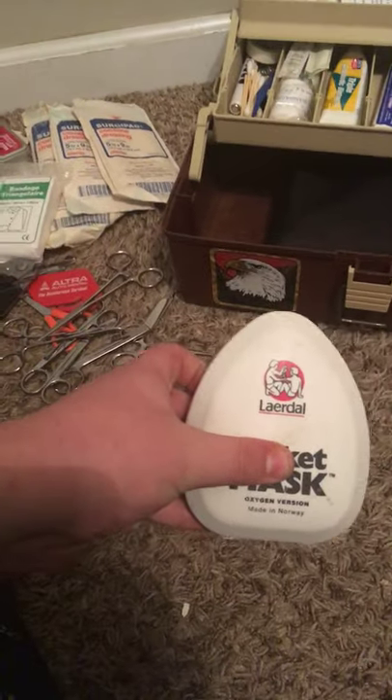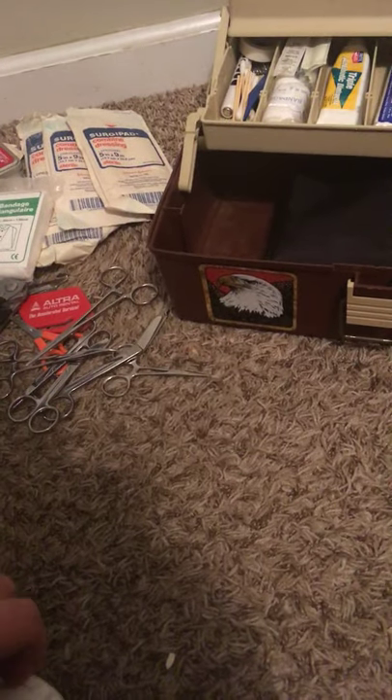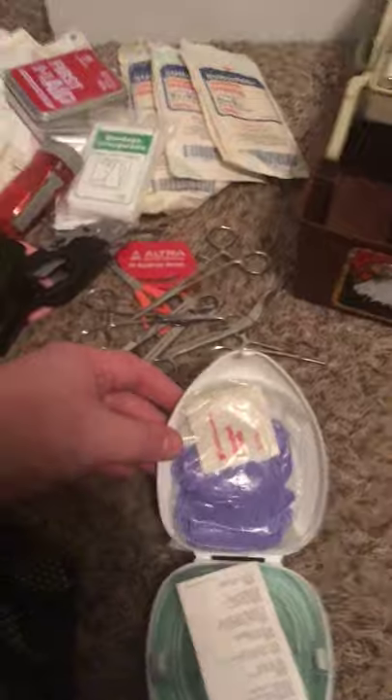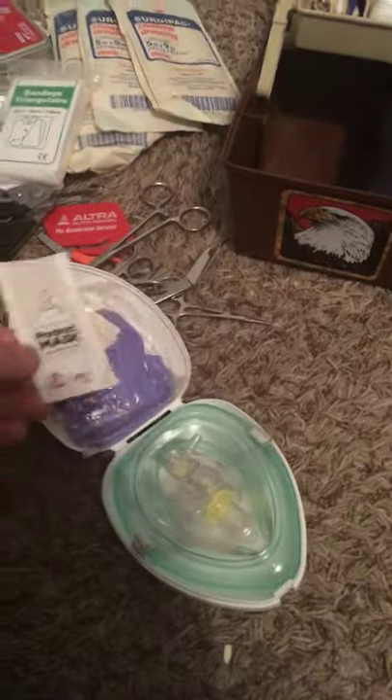Then I have a CPR pocket mask by Laerdal. Fairly old one, but it's kept clean and sterilized — I'll probably wash it again after this. The gloves and alcohol pads were bad and the gloves were just disintegrating. It has a little instruction manual, the mask itself, and valve.